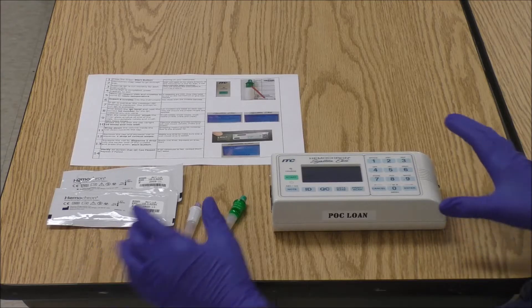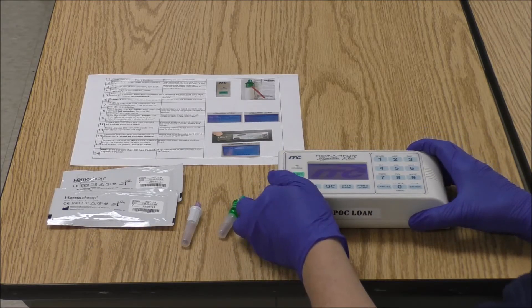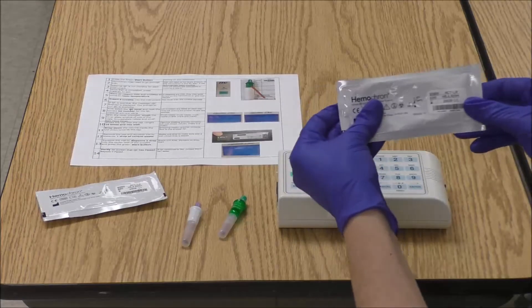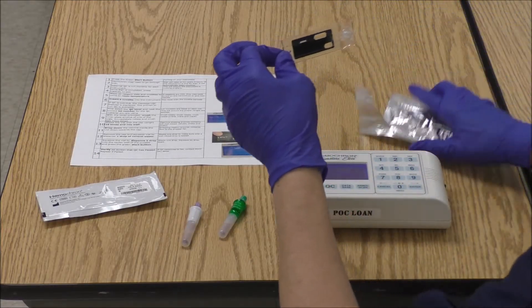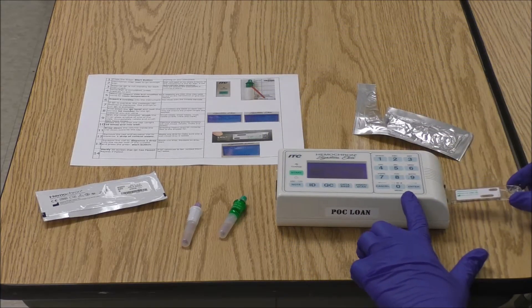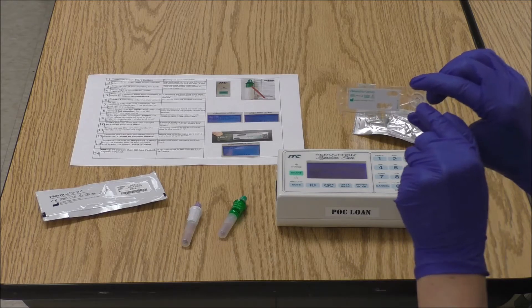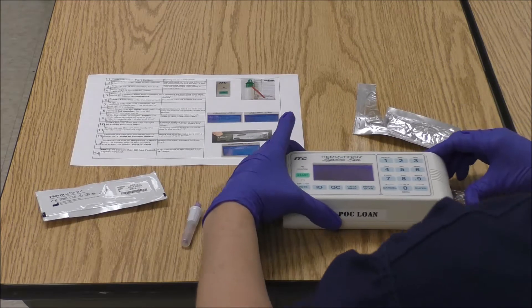The first thing we're going to do is press the green start button. Take your cuvette and open it up. The cuvette will be inserted in the instrument right here at this port. The part where you want to place your drop of QC material is that center circle. Push your cuvette in all the way.